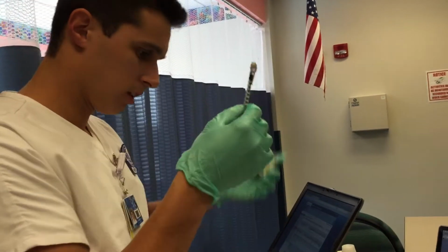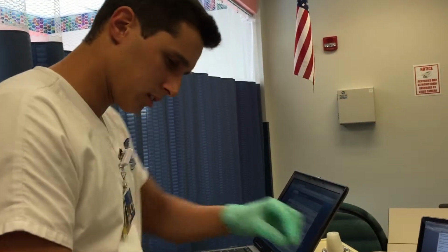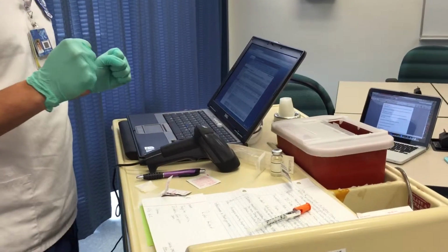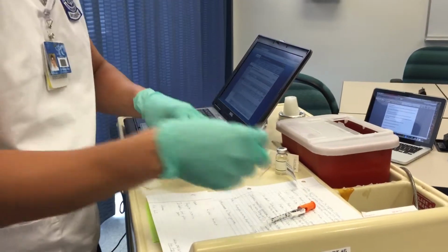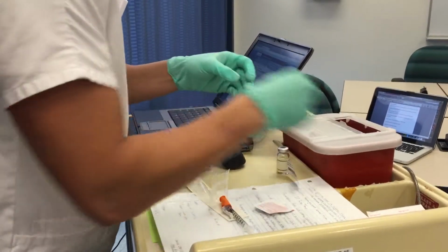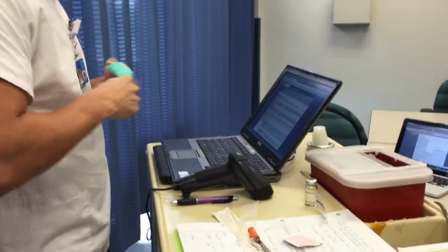Okay. It's here. I'll cap it like this so I don't risk sticking myself. And I think we're good to go. I have a wipe here for this insulin. I'll put it back here just to see if we can throw it away. And we're ready to go in. You ready? Yep.